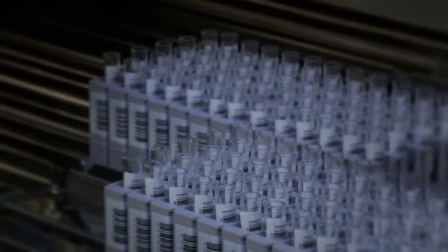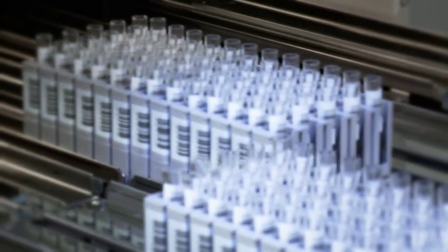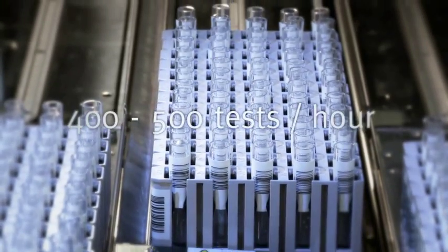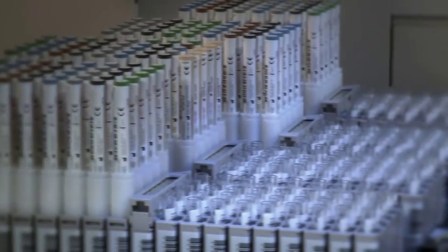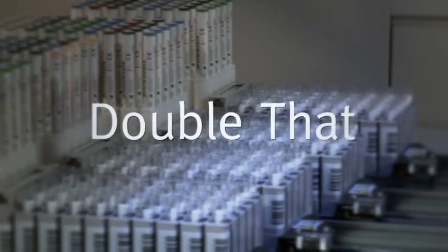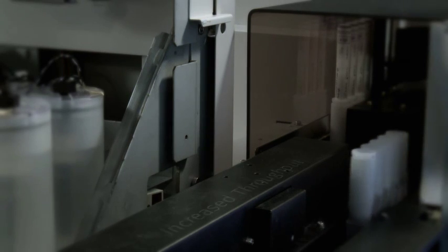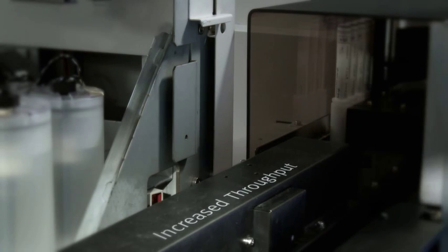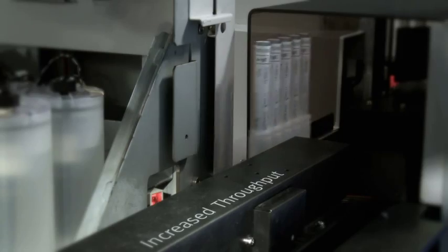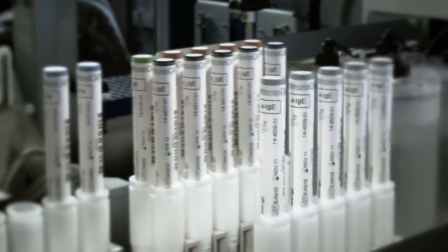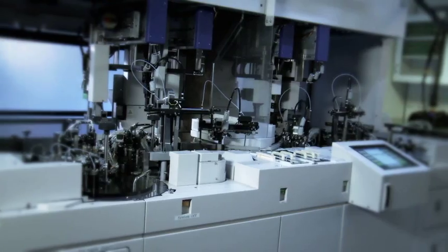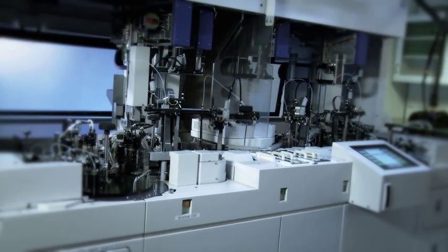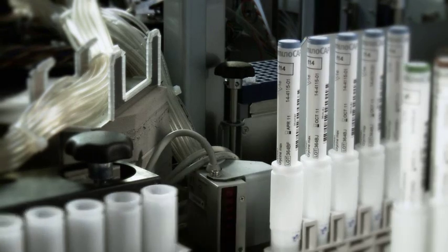Each FADIA 2500 can produce from almost 400 and up to nearly 500 test results per hour, depending on your setup. Double that for FADIA 5000. This means an increased throughput of at least four to five times that of any other combined allergy and autoimmunity instrument available today. Simply put, your lab will have the capacity to meet the needs from any market.